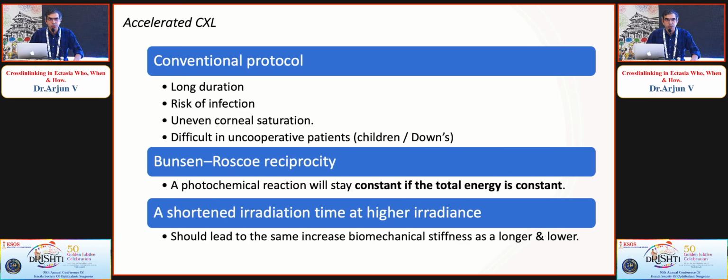With the conventional protocol, the biggest problem is the duration. It's a long procedure, so there is a risk of infection. There may be uneven saturation. In uncooperative and difficult patients, it is hard to do.